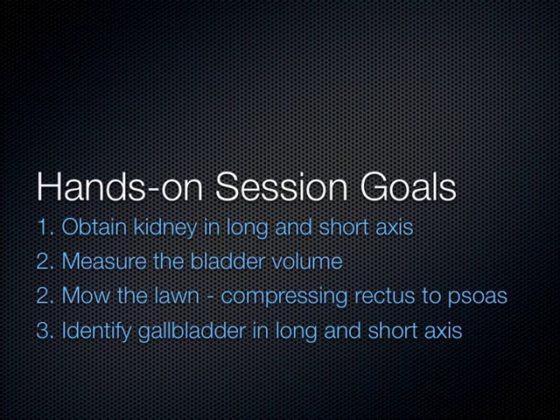You're going to mow the lawn, compress, get that rectus abdominal muscle to come all the way down, to come in contact with the psoas muscle, and then I want you to show the gallbladder's long and short axis. Any questions about this talk? Okay. Yes? Putting the right leg as far as you can over the left, why?